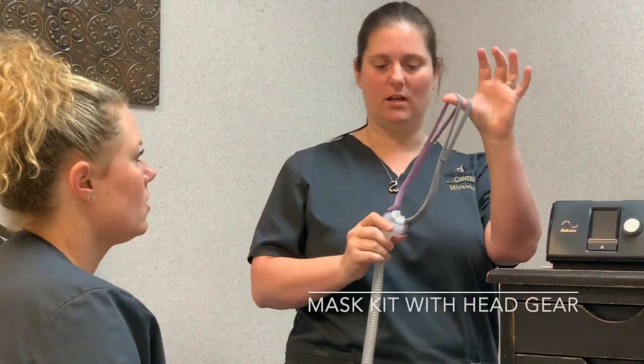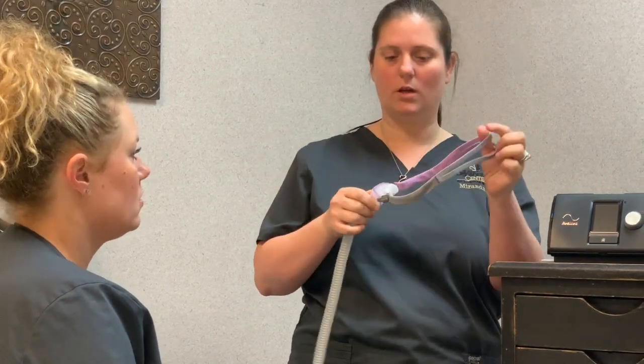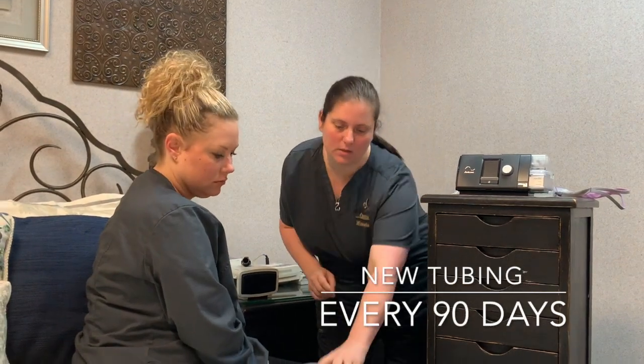This is your mask with headgear. This is the headgear part and this is the mask kit part. You can replace this every six months if you choose. Every 90 days you're eligible for new tubing, which is right here.